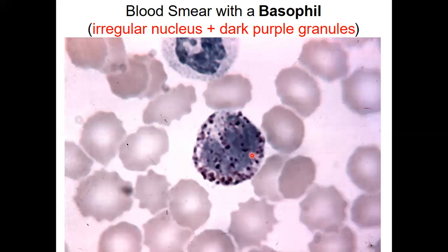But basophil specifically picks up the basophilic stain, whereas the eosinophil picks up the eosinophilic stain. So this is what you need to draw. Demonstrate the nucleus, which is shadowy there. It's not so clear because of so many granules inside the cytoplasm. Then show the granules as well.